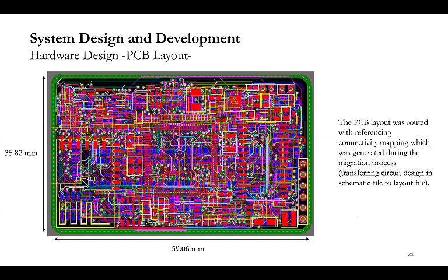Oh, no. I follow all the EMI and EMC rules, like shielding, to avoid crosstalk. In PCB design there are challenges like crosstalk, which means if the traces are really close to each other, the signals interfere with each other.